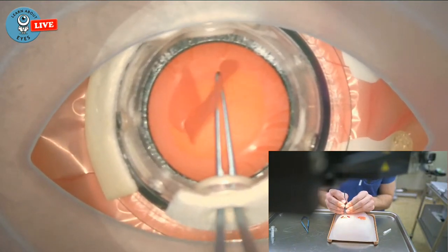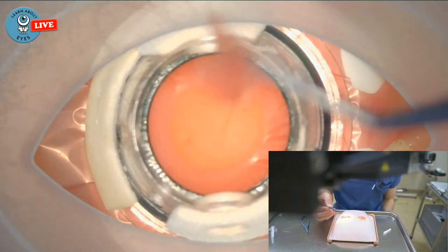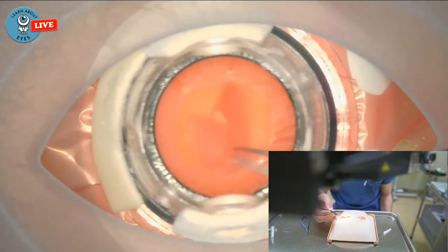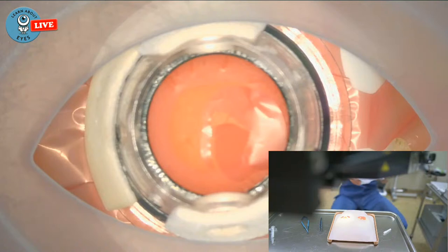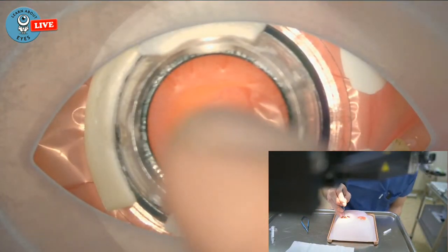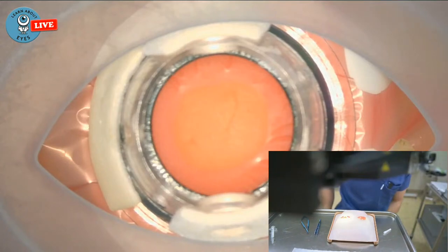Getting a bit smaller here, so let's take it out and boom. Now these tiny things here, they do fly around quite a lot. So what I like to do is I take a piece of this, which is just a wet wipe that we use to disinfect things, and I just put them on there, because I don't want them to be flying around the room. Definitely don't want them to be somewhere on the floor in an actual OR.